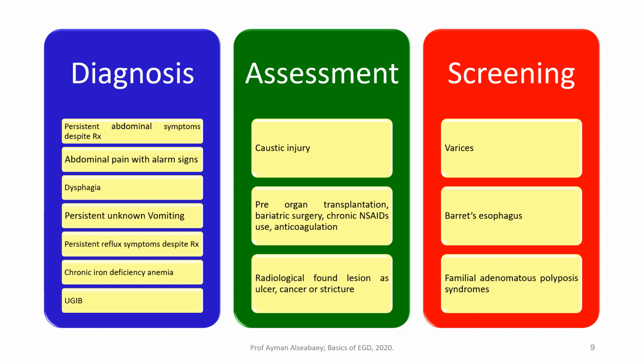Of course, any patient who will undergo any organ transplantation, liver, heart, lung, should undergo diagnostic EGD, especially to detect ulcers, because you know that during and after the operation, the patient will take a lot of medications, including anticoagulants. This is very important.